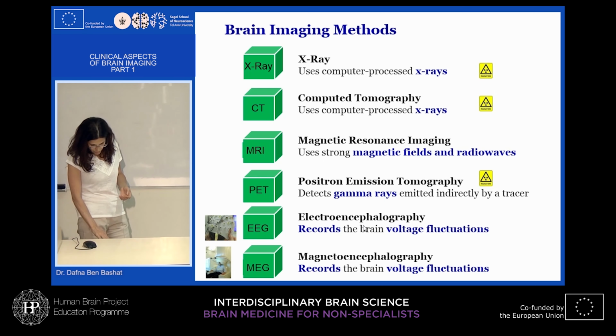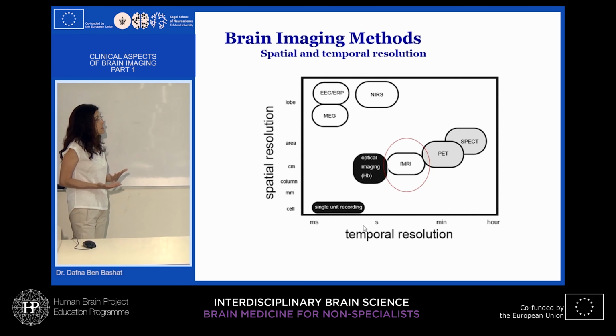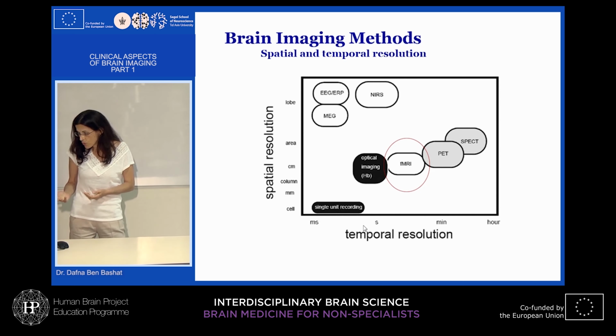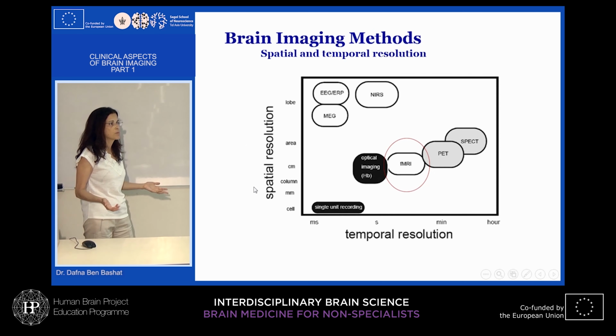But in this lecture, I will focus only on MRI. There are several advances of MRI, which are beyond other methods, and I want to emphasize them. First, if we are talking about resolution, when we get an image, we are interested in having good spatial resolution.